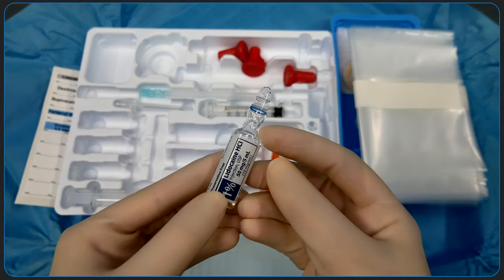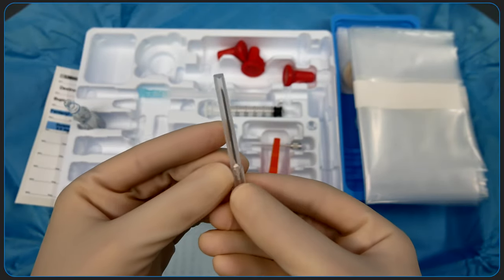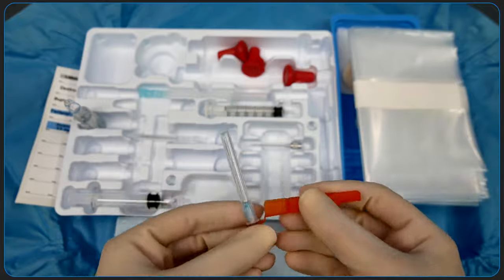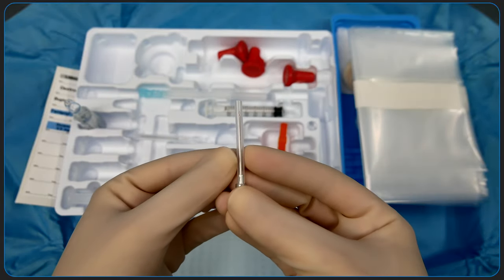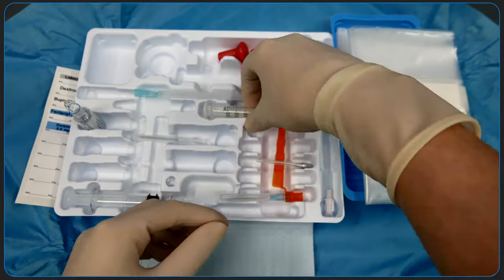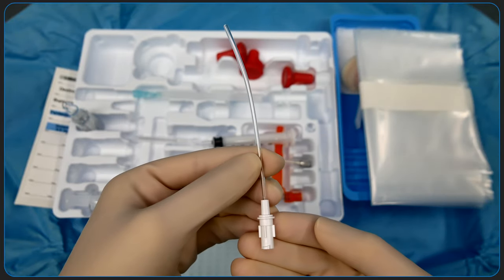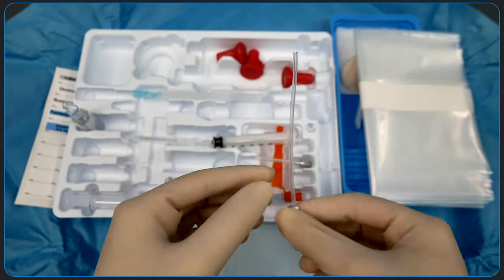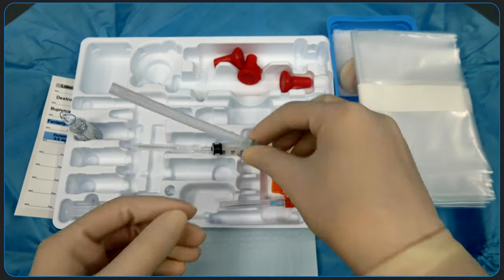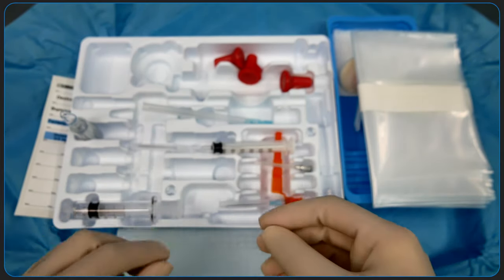The kit comes with a 5cc 1% lidocaine vial, used for local infiltration to anesthetize the skin. A 19 gauge filter needle. A 25 gauge 1.5 inch needle for subcutaneous infiltration. A 1.25 inch introducer needle, through which the spinal needle will be inserted. A 3cc slip tip syringe. A filter straw, with which you'll draw up your local anesthetic. A 25 gauge 3.5 inch Whitacre spinal needle. And a 5cc glass luer slip tip syringe to hold your spinal anesthetic.